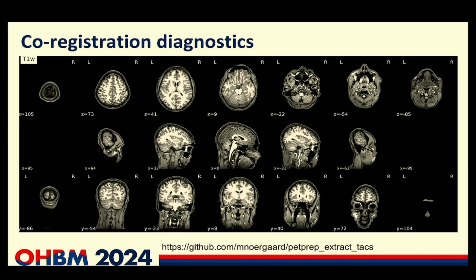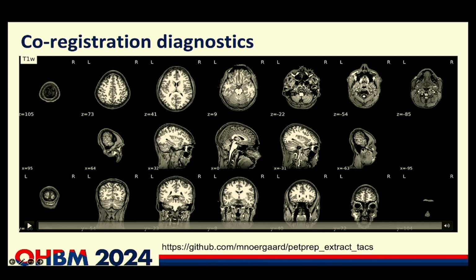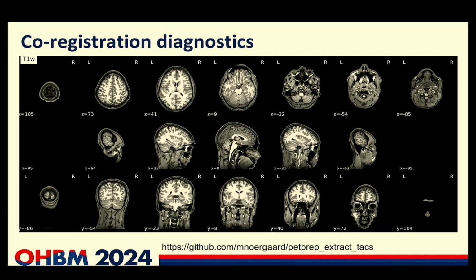What's running under the hood here is the FreeSurfer function called mri_coreg, which is basically similar to the SPM implementation by John Ashburner many years ago. And you can choose different cost functions. Here it's using normalized correlation, which seems to perform quite well for these cases, but of course it can be different depending on your registration problem.